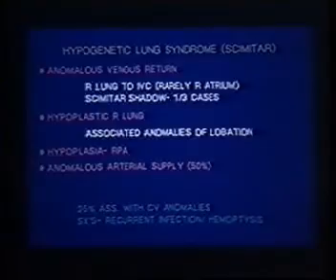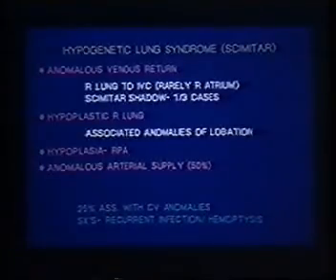I would draw your attention to how difficult, if not impossible, it is to identify this vessel on the right side. A simple spin echo image may, in fact, not be adequate to define anomalous vessels in this population of patients. Suffice it to say that the angiogram here was definitive. You can see there is, in fact, an anomalous vessel to the left lower lobe, but this is a selective injection into the obviously large vessel feeding the otherwise normal-appearing lung in the right lower lobe in this patient with bilateral sequestrations. So I still think that MR is the way to go to evaluate these patients, but I am a little gun-shy now about saying that simple spin echo technique is sufficient.